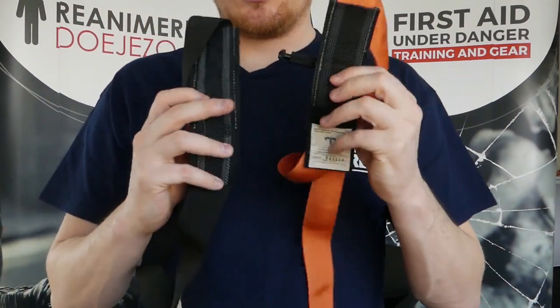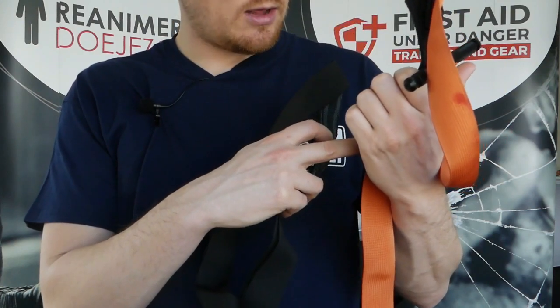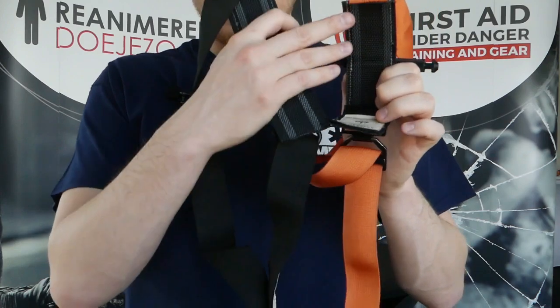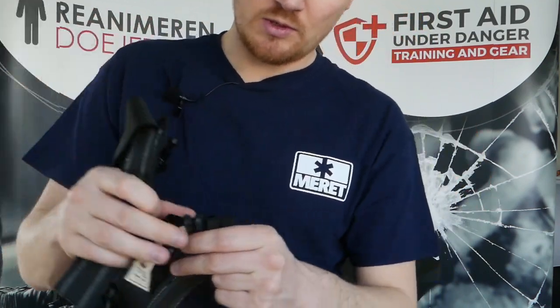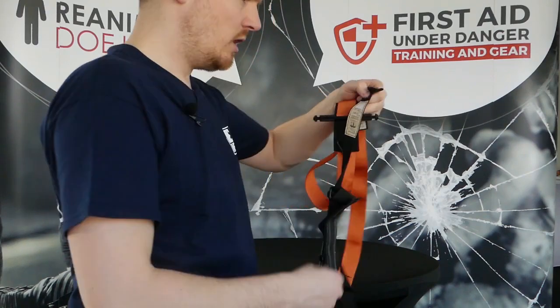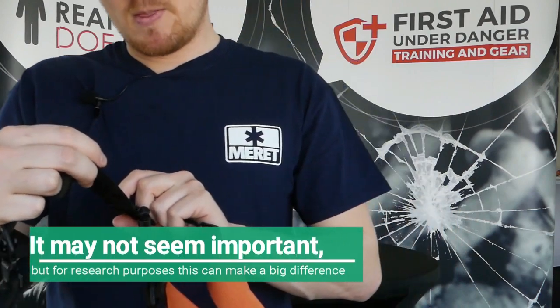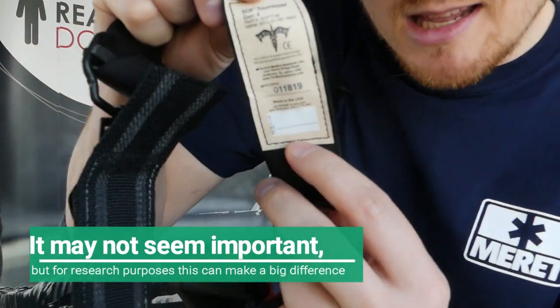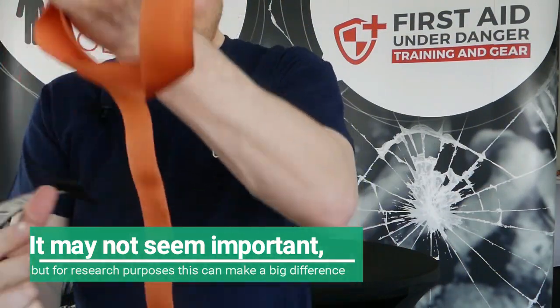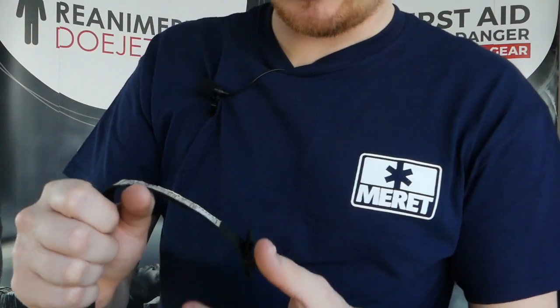For example, the sticker of the company and also where the date of manufacturing is made has been swapped out from this side to, let me take the elastic bandage off, to this side, so it's on the end of the tourniquet. And there's even still, you see, a little possibility to write down the time, and I believe that same possibility was here on the tourniquet on the end.